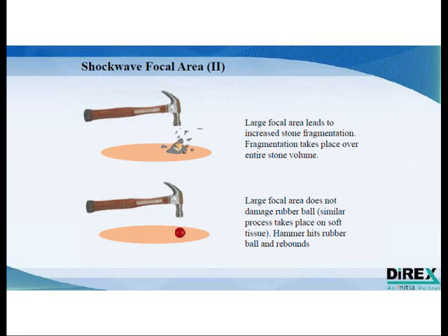If you hit a stone with a hammer, you will be impacting the entire volume of the stone, and thus you will be fragmenting not a specific area but the whole stone, which is considered efficient.